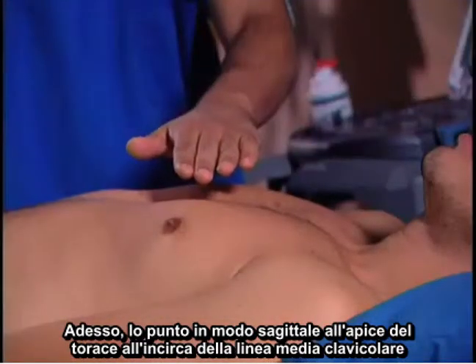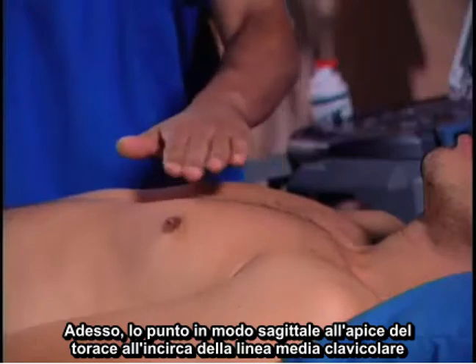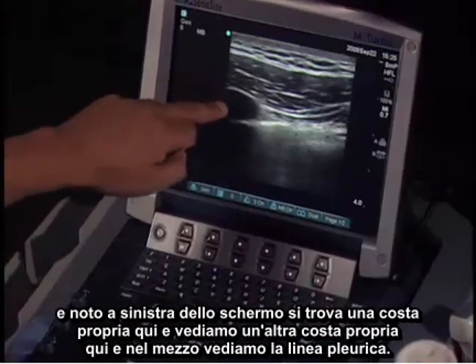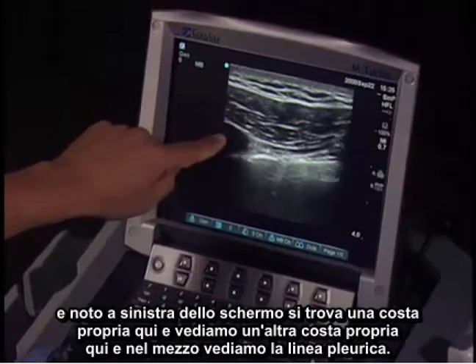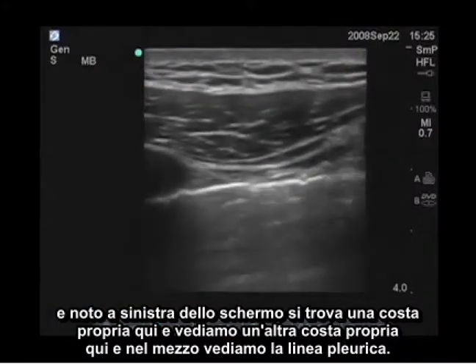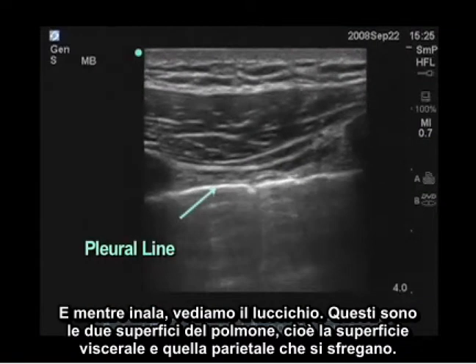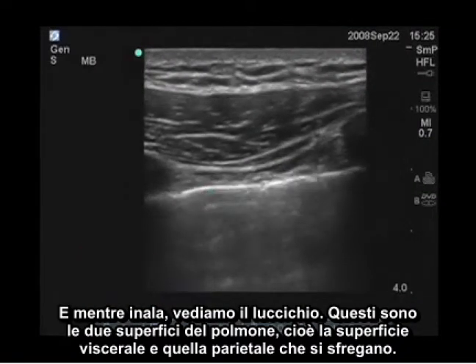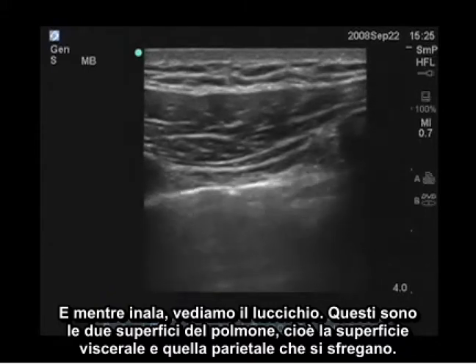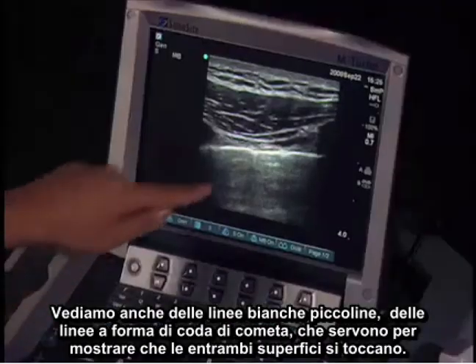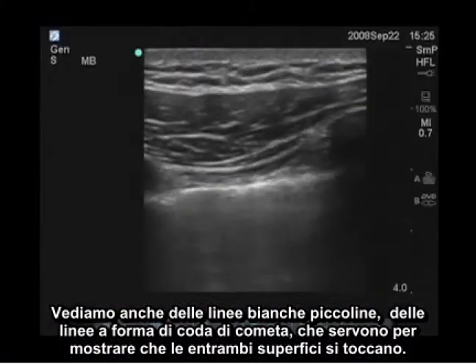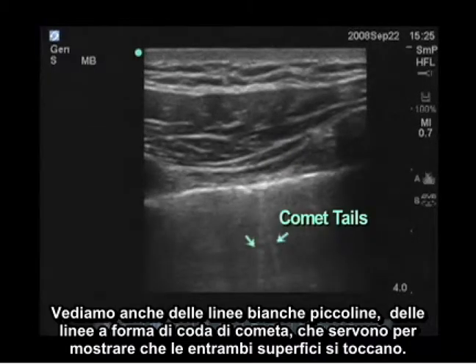Now I'm going to scan sagitally at the highest point of his chest at about the mid-clavicular line. To the left of the screen is a rib, and we see another rib to the right. In between the two we see the pleural line, and as he takes a breath we see shimmering — these are the two surfaces of the lung, the visceral and the parietal surface rubbing together. We also see little tiny white comet tail lines, which show that both surfaces are touching together.